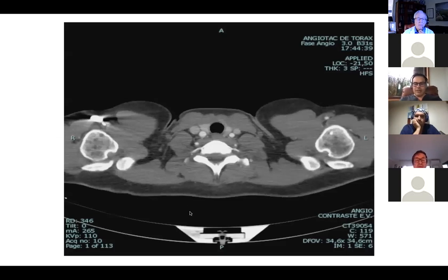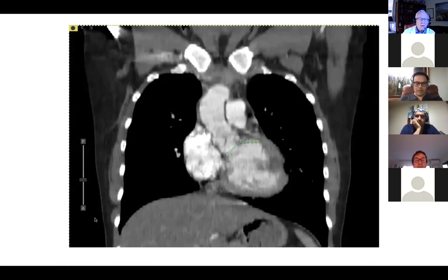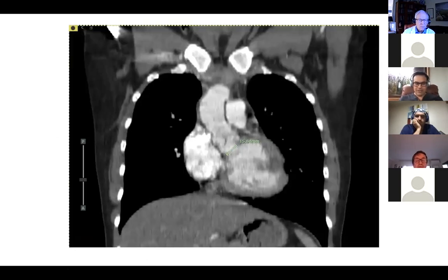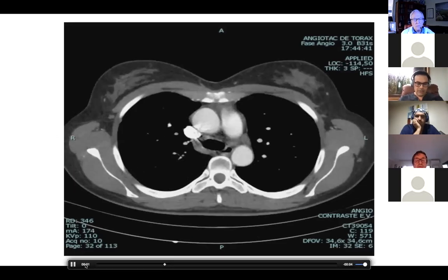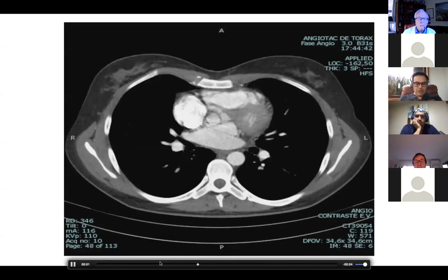This is the CT scan from that moment, the year 2012. I just want to show you, she had a quite normal aortic root and ascending aorta. Sorry, it's a little difficult to control the scrolling, but here you can see the aortic annulus. The radiologist measured around 15, 16 millimeters, and the aortic root and ascending aorta were quite normal. Just give me one last chance to try to control the scroll. Yeah, here.